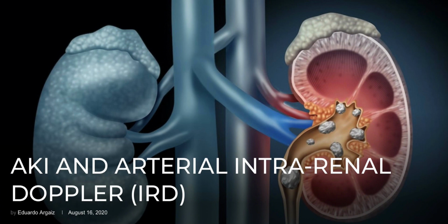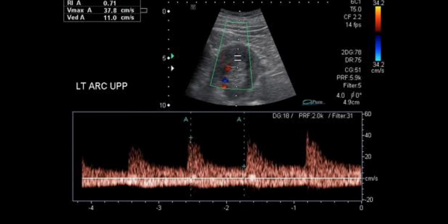Much of the time when you call your radiologist colleague to perform a Doppler ultrasound of a renal transplant patient, maybe on the first or second post-op day, and you ask about a collection, they give you some important information, a number on the ultrasound which we call the resistive index. What does this number mean and how is it derived?